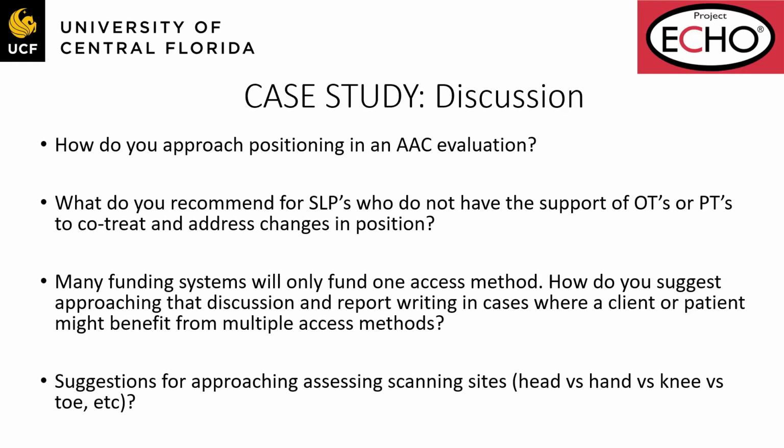But lots of observation, because there are also things that we all do as people that we don't even realize we're doing, and sometimes you can translate that. Like, oh, I noticed you're really good. I have a client that's really good at hitting the little horn button on his power chair to get somebody's attention. Well, if you can touch that button, like you've gotten in this habit, we can put a switch right next to that button that now is one of your switches. Picking and choosing what you see already going on.